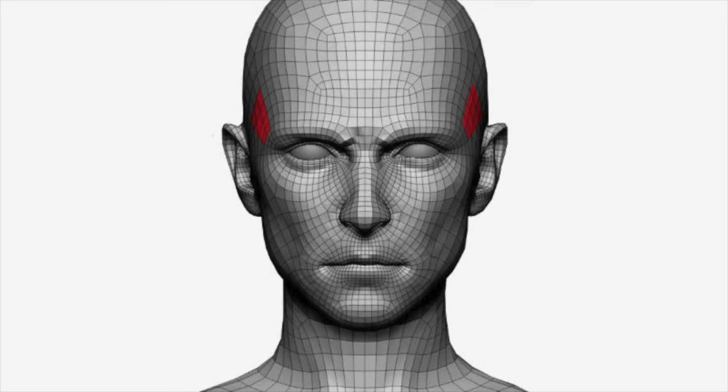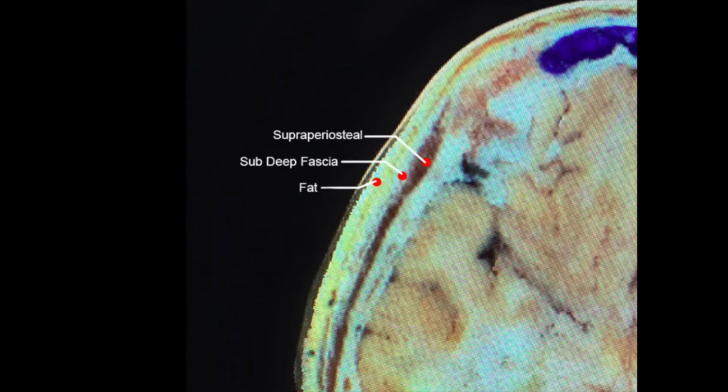What should you know? There are 3 different planes for filler deposition. Some practitioners prefer one over the other. Personally, I inject into all 3 different planes, because of the aesthetic outcome I am looking for. The plane of injection depends on the patient condition presented at the time. It is a balance of risks versus results.